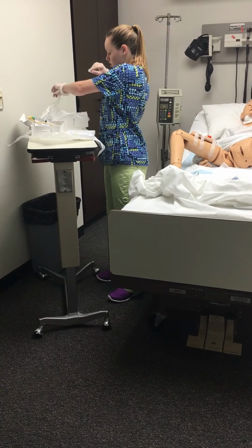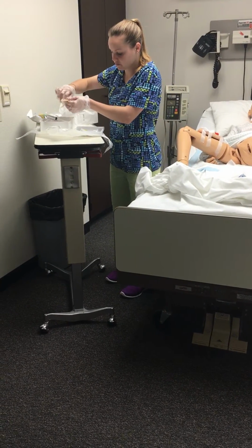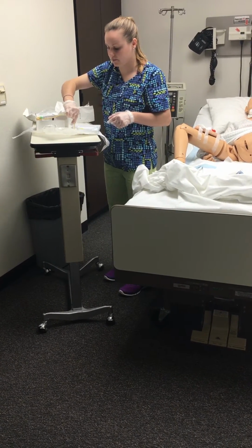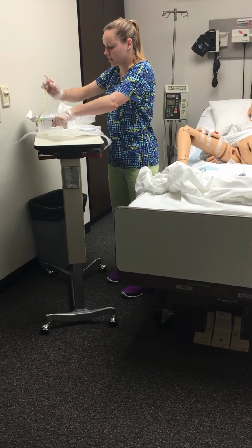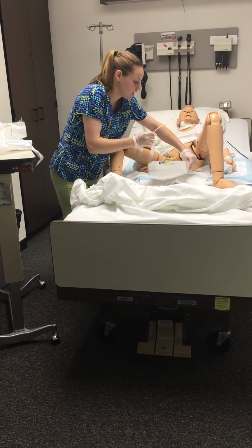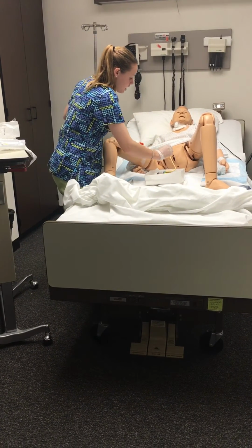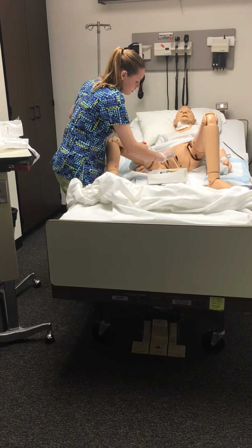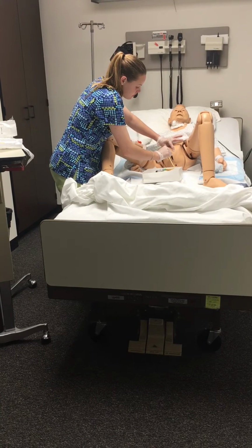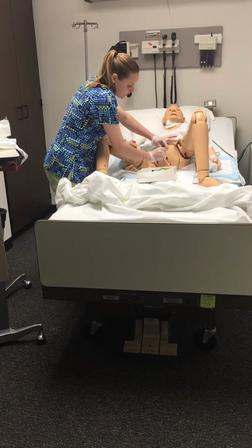Sterile. Okay. And then we're going to lubricate this right now, where I just squirted the lubricant. Roll it around there. And now that's lubricated, I can place this down in between the patient's legs. And I would insert the catheter, holding back the labia, until I saw urine return.